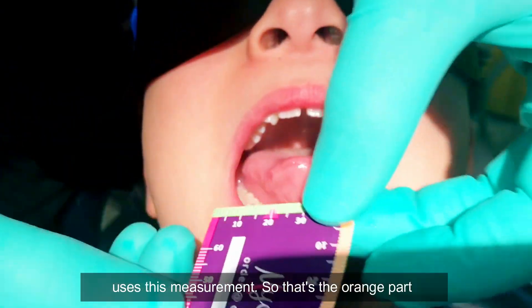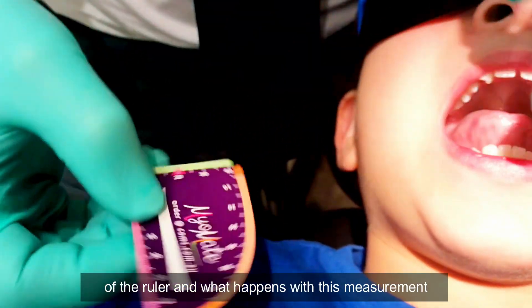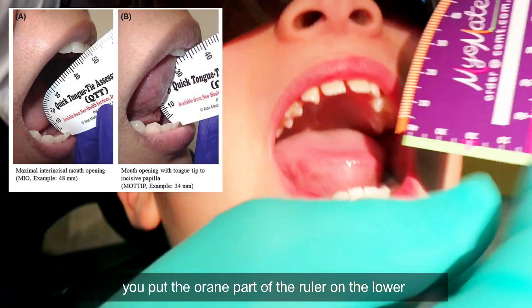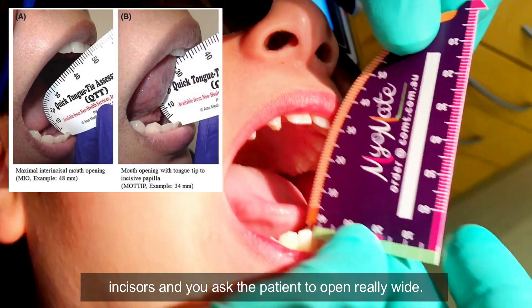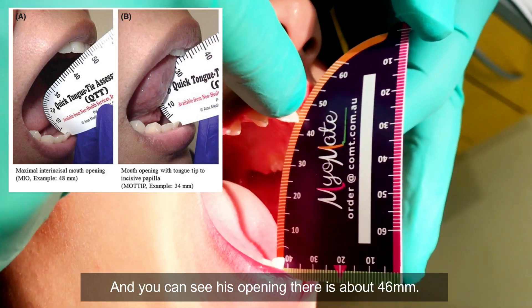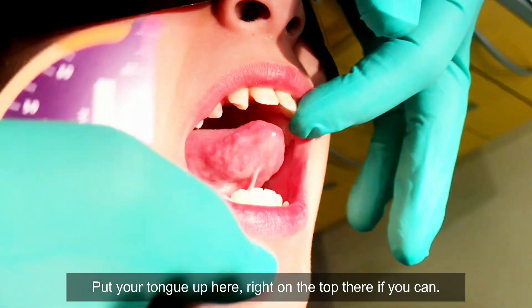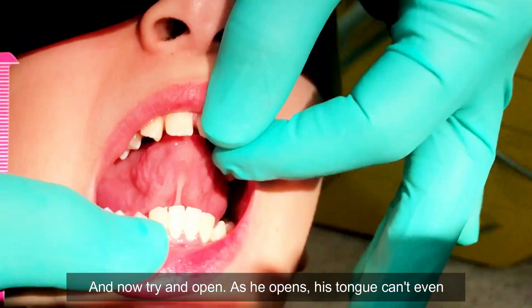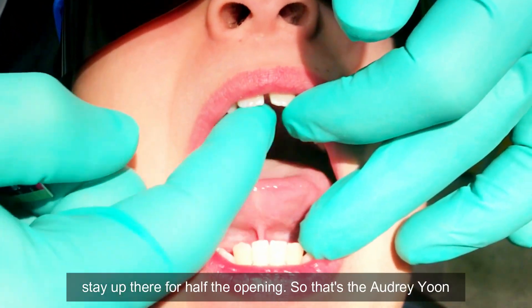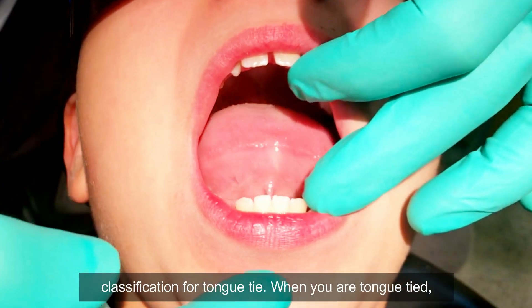Then Audrey Yoon uses this measurement. That's the orange part of the ruler. You put the orange part of the ruler on the lower incisors and ask the patient to open really wide — you can see that his opening there is about 46. Put your tongue up on the top there if you can. Now see as he opens, his tongue can't even stay up there for half the opening. That's the Audrey Yoon classification for tongue tie.